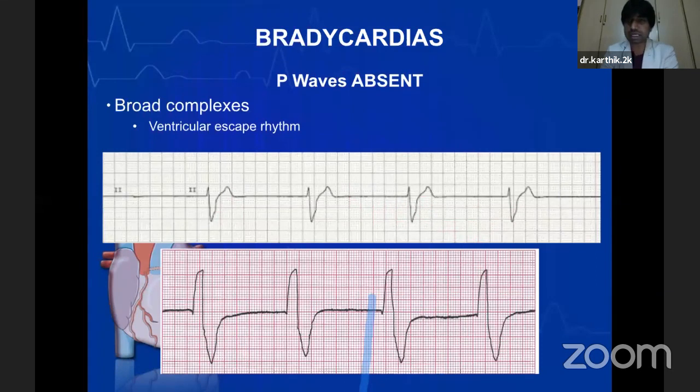Now sometimes patients can have bradycardia with a wide QRS complex. That means all the higher pacemaking authorities like the AV junction and the SA node have failed to generate the impulse, in which case the His bundle, the Purkinje fibers or the ventricles themselves have taken over the activity of pacing, which is called a ventricular escape rhythm. You can see that the QRS complexes are wide, there is bradycardia, and there are no P waves here again.